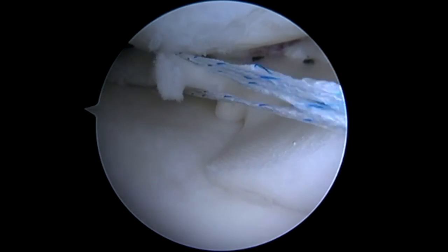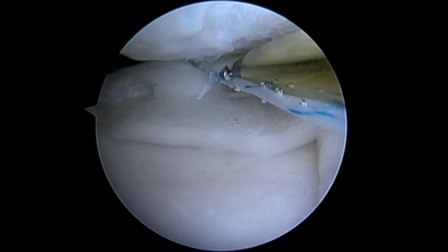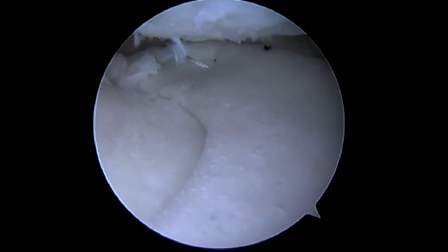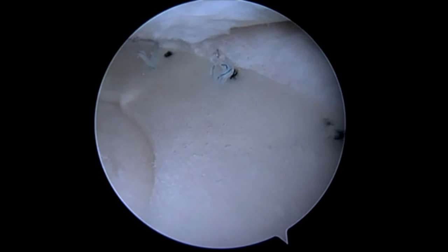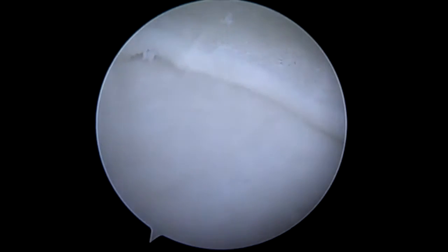Once we've got that posterior horn secured down quite nicely — and you can see the extent of our implant — we go ahead and tie this knot. There are markings roughly every eight millimeters on the CMI implant; this is where I'm going to place my additional 360s. Once we get this up against the capsule, it's approximation — and we've got excellent volume replacement with our CMI implant.